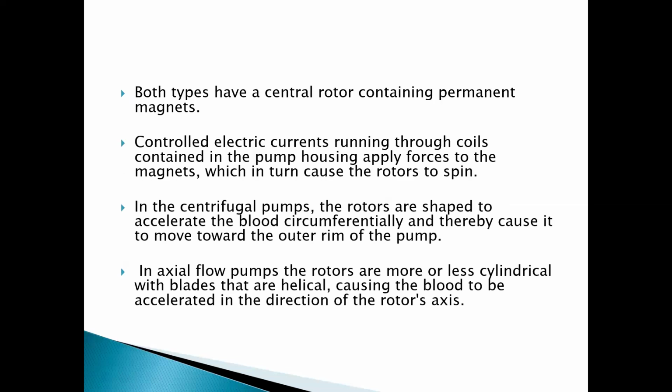For the centrifugal pumping system, it transports the fluid and converts rotational kinetic energy to a hydrodynamic energy flow. Centrifugal pumps have a very high flow rate capability, so most of the pumps being used now are produced with this centrifugal pumping mechanism.